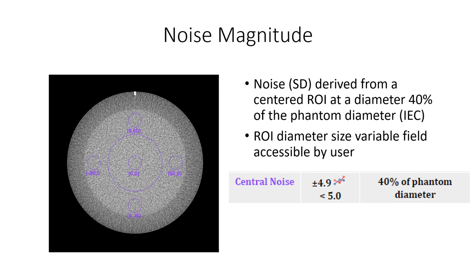Noise magnitude follows IEC guidelines with a measurement using a central region of interest sized at 40% of the phantom diameter. This diameter parameter is accessible by the user through the report profile manager.